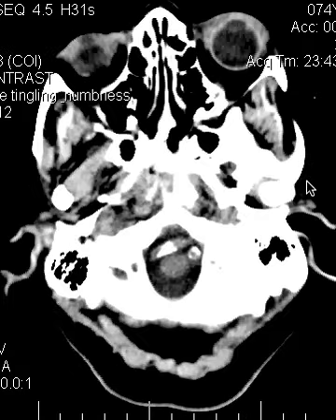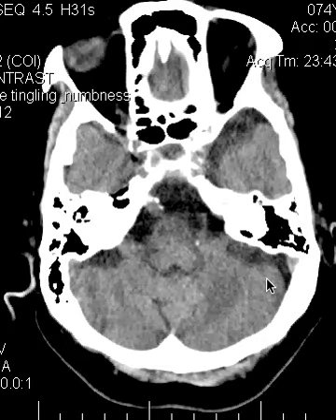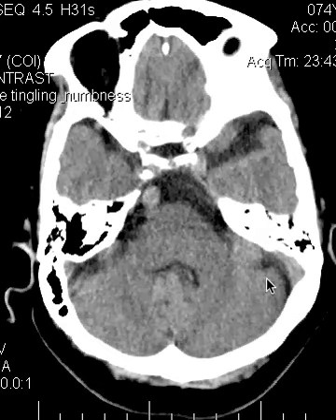All right, now, starting out at the bottom, you should be very comfortable with this anatomy, or getting there at least. Here's the foramen magnum, and here's the medulla. And here are the two vertebral arteries with pretty prominent calcifications. We see that pretty often. And they kind of curve around, which is normal. And then they form the basilar artery.